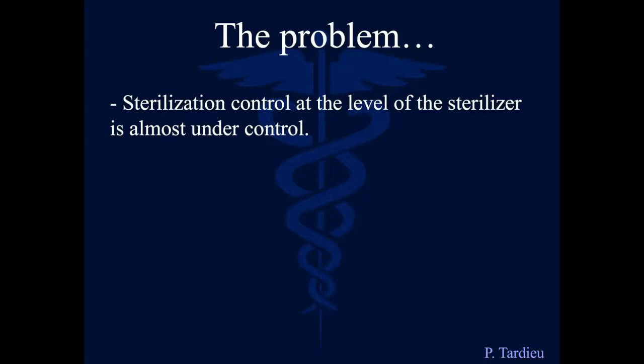What you can do also is to use some special instruments. We're going to talk about that, some kind of probes that will show you in the morning or once a week or once a day that your sterilizer is working in a good way. You can also do that. So I'm not going deep into this process, but we know how to define that a sterilizer is working well or is not working well.